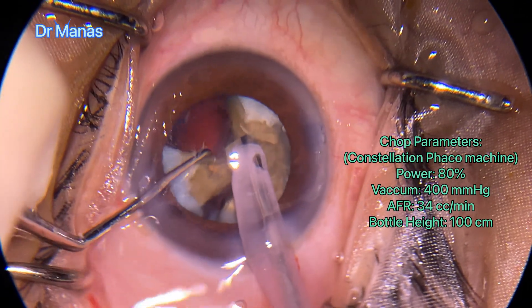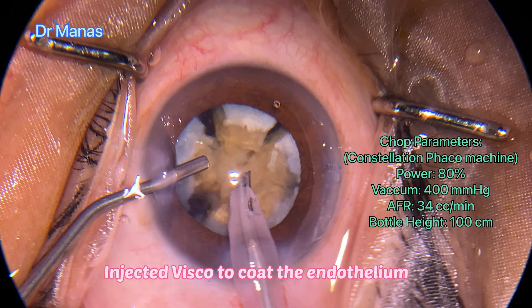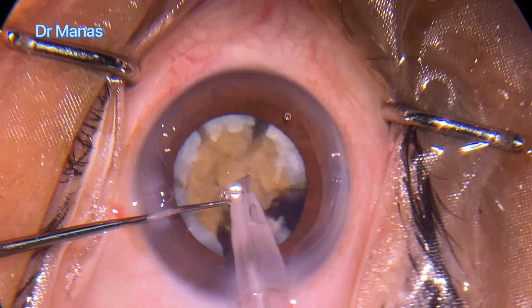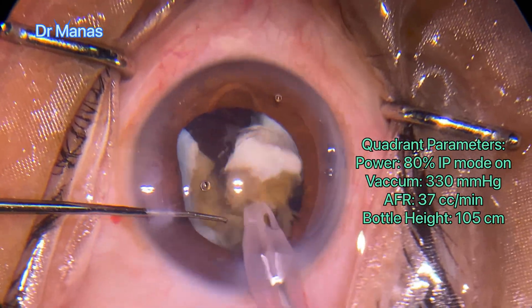You can see that the cortex is calcified. I didn't want to allow the chamber to collapse suddenly, so I injected viscoelastics before taking out the probe. Now I started quadrant emulsification with the parameters mentioned.